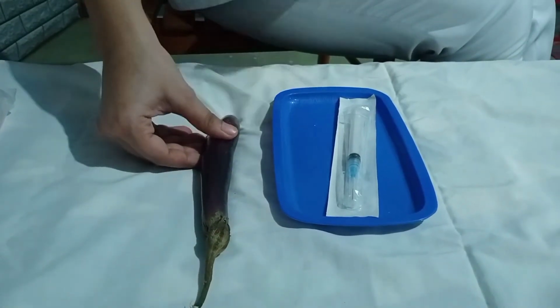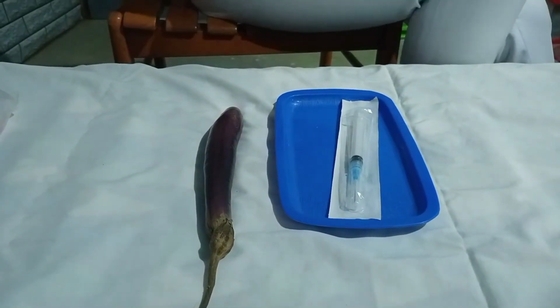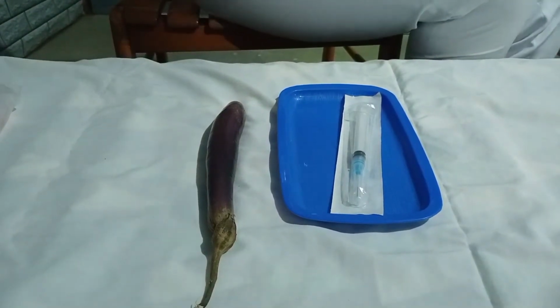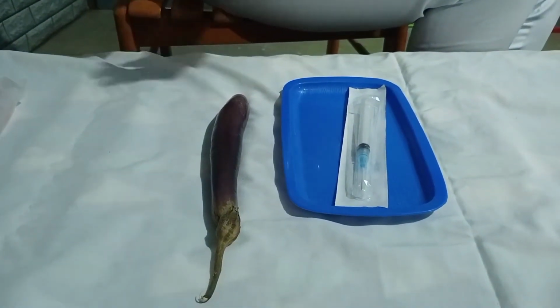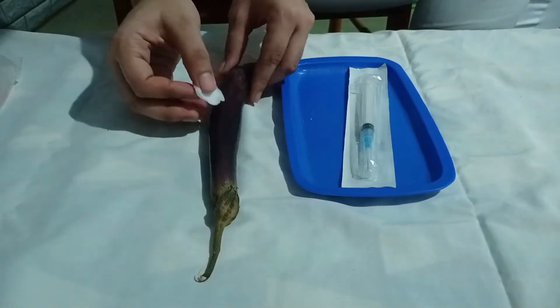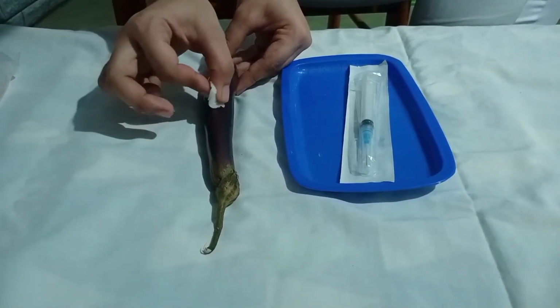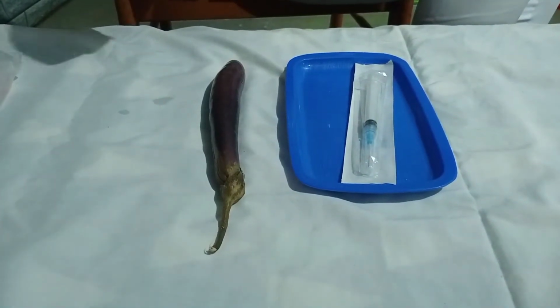So I'm going to cleanse the area to be injected using a firm stroke of circular motion from inner to outer. I'm going to get a cotton that has been soaked with alcohol, and the rationale for this is that friction aids in cleansing the skin. A clean area is contaminated with soiled objects if you rub over its surface. So I'm going to cleanse the area with circular motion from inner to outer, like this. Okay. And throw the cotton properly.